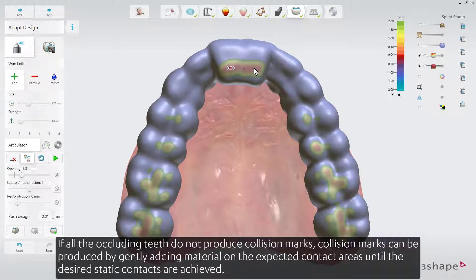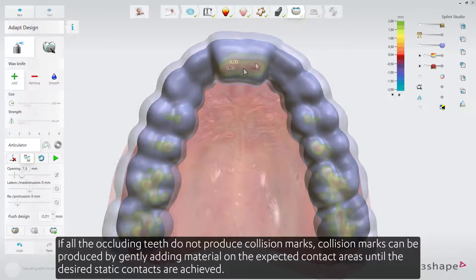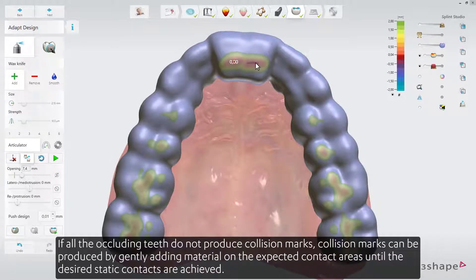If all occluding teeth do not produce collision marks, collision marks can be produced by gently adding material on the expected contact areas until the desired static contacts are achieved.